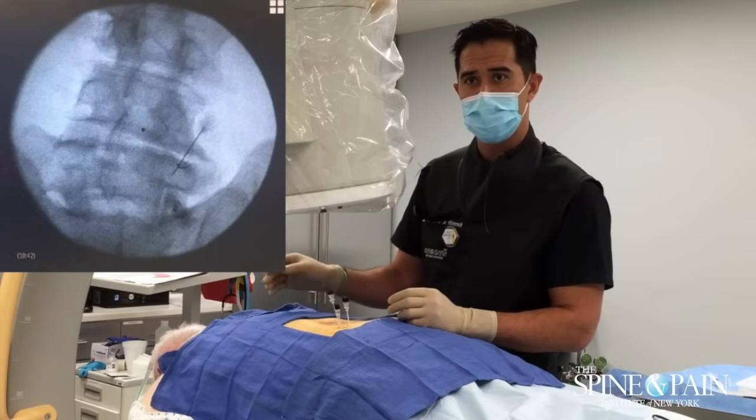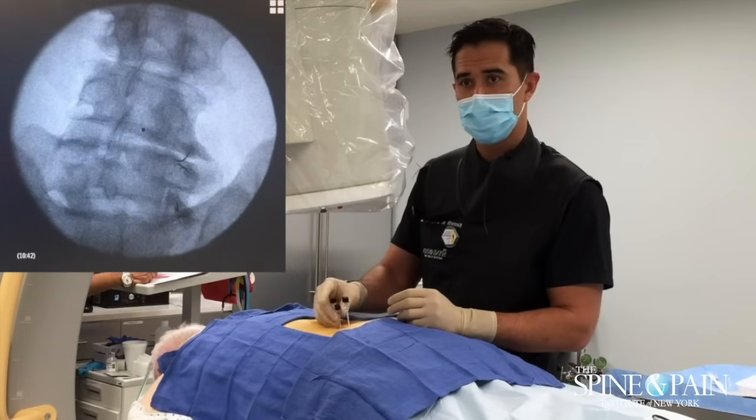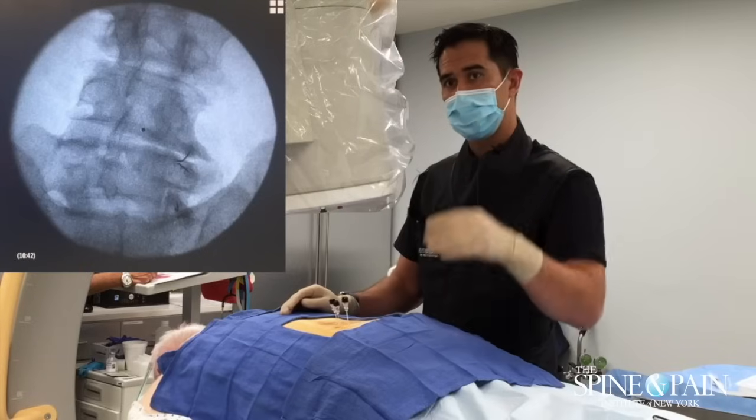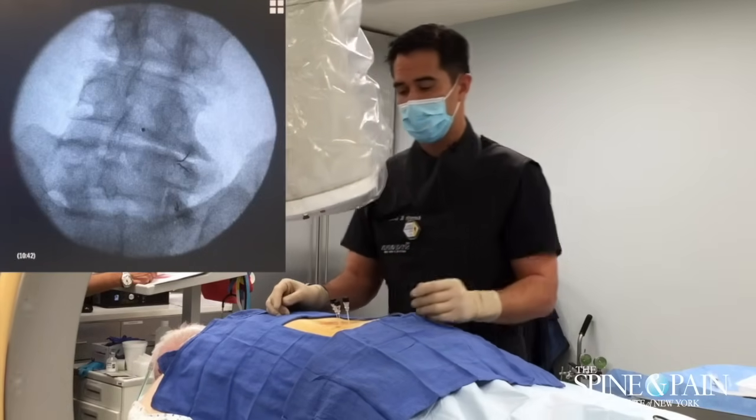In this case, as you can see, he's got some degeneration in there. You can see that this space is narrow. It's got some osteophytes at that level on the oblique, but that's at the vertebral body — that's in front of where we're working.